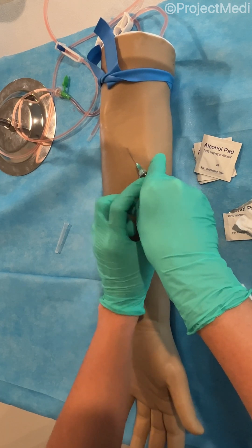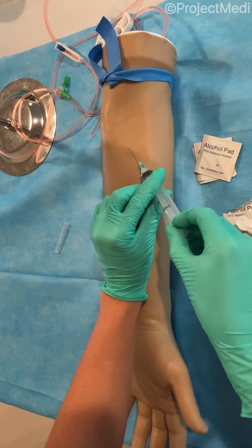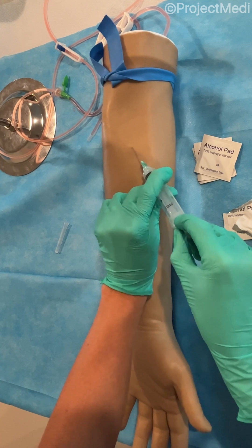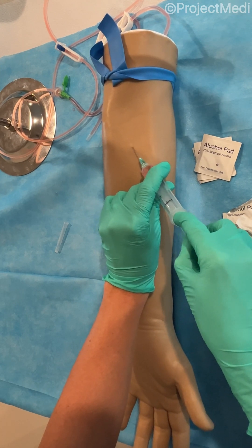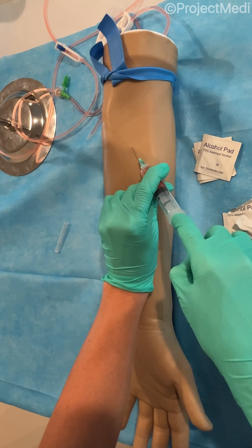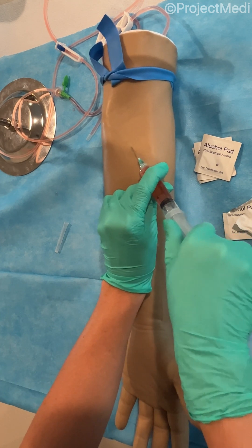When you have the needle in, you're going to see a flash, so you want to hold with your non-dominant hand to keep the syringe and needle in place. Then you want to gently pull back on the plunger, filling the syringe with the blood to collect your specimen.